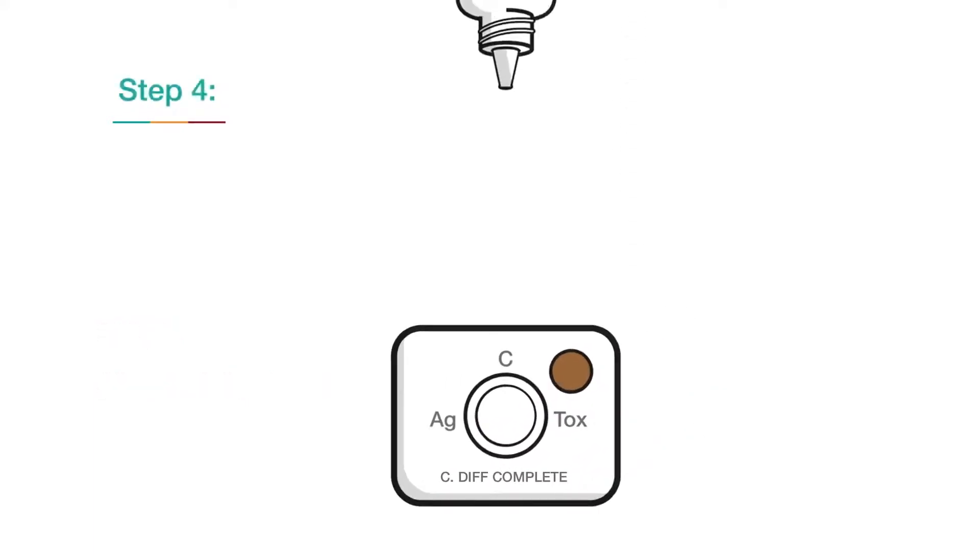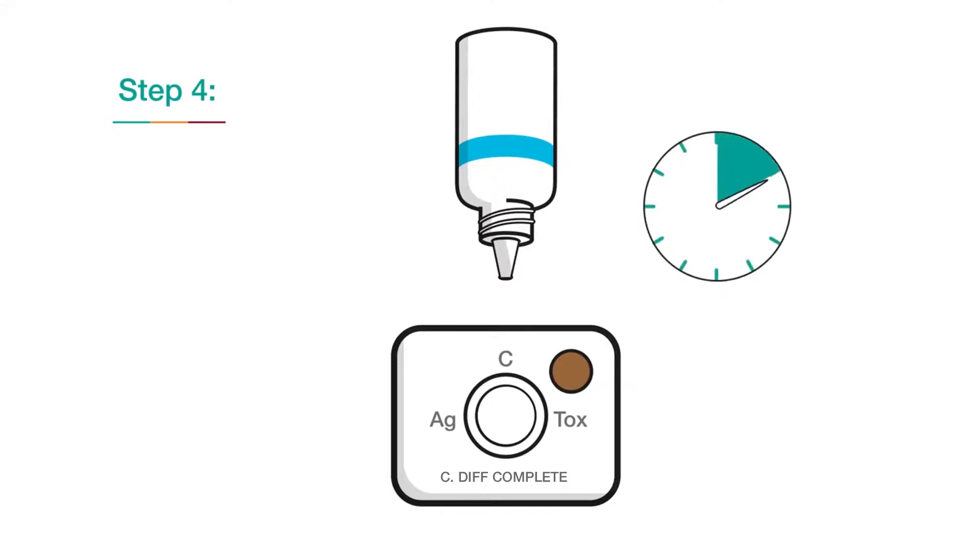Add two drops of substrate to the large reaction window. Incubate for 10 minutes at room temperature.